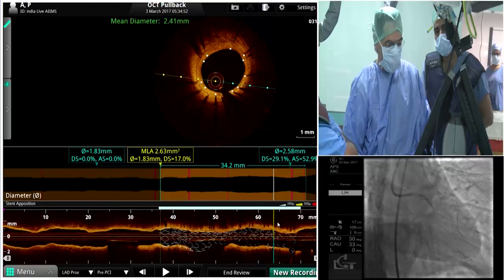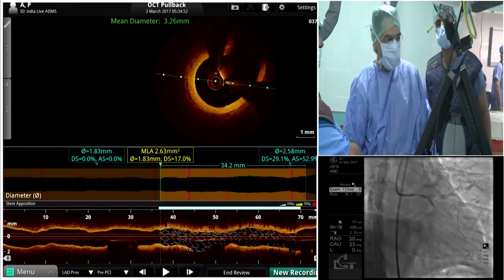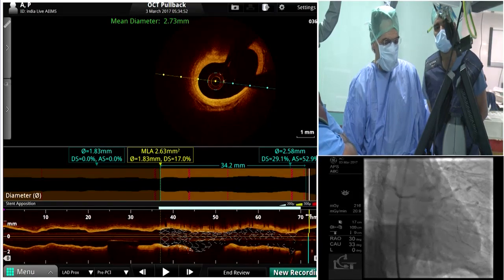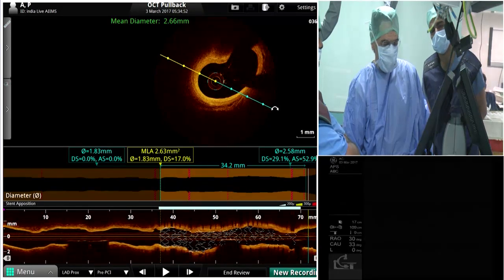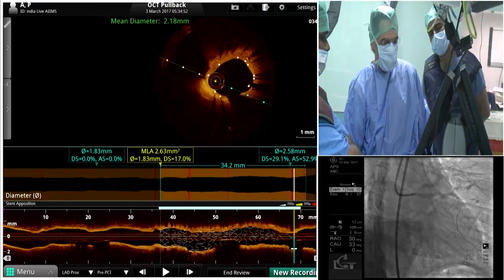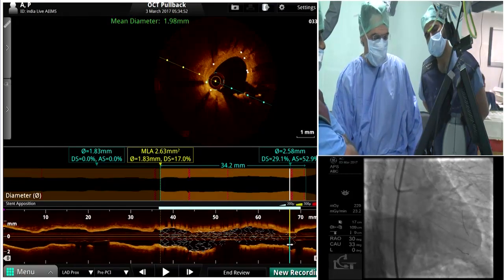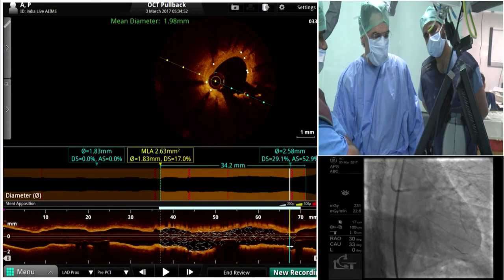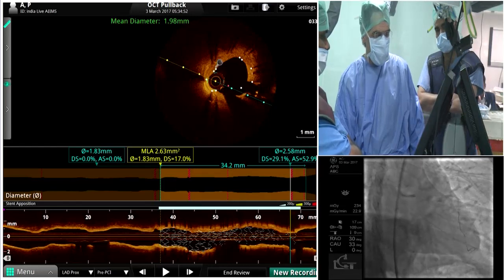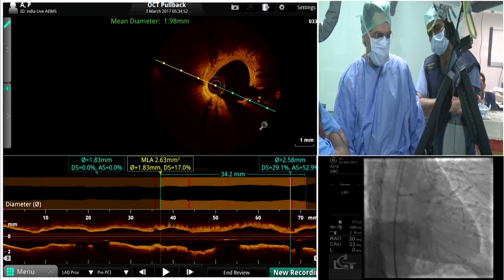Then from the lumen contour, you may see this is the left main. You can see that there is no stent at this point. And then we are approaching the branch of the circumflex. You can see the wire going in, and then there is the stent starting. So the points are, number one, where the stent is landing. And here you might see the two wires with a very tight stenosis. This is one wire, this is the second wire. You can see the shadowing. I'm taking out the rendering of the stent, so you can see clearly.